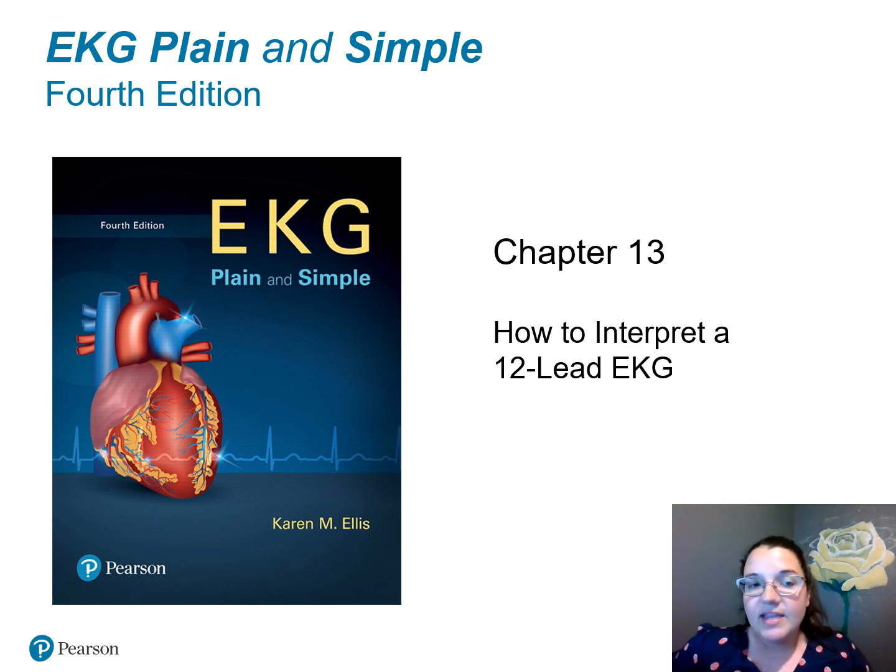So just to recap, in EKG 1, we learned how to interpret one rhythm. You learned about 33 rhythms, and we learned how to interpret those rhythms by steps, and you had to memorize your 5 steps. You had to answer the questions and ask yourself, are they QRSs? Are they uniform? Are they matching? Are they P waves? Are they uniform and matching? What are my intervals? What is my heart rate? And so forth. So we're going to do the same thing in EKG 2.